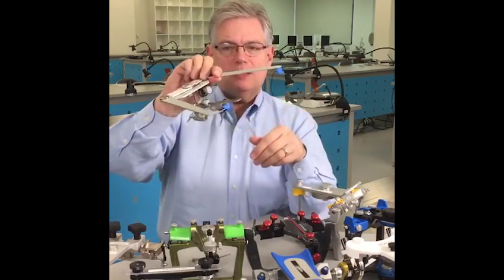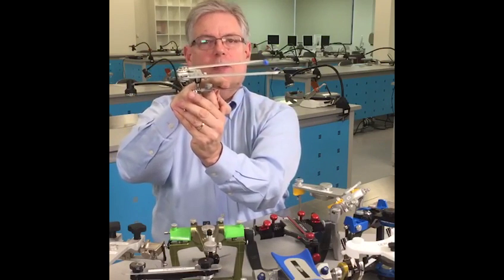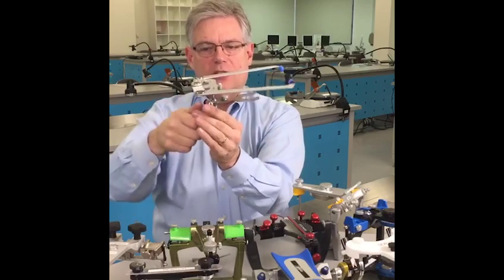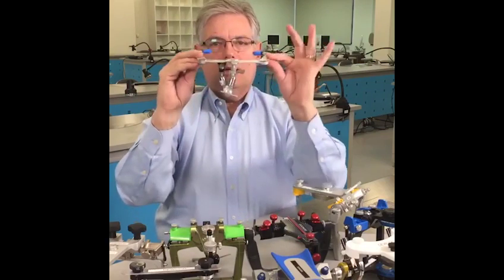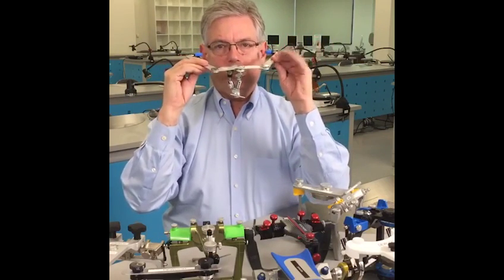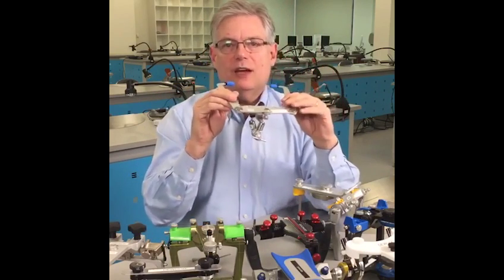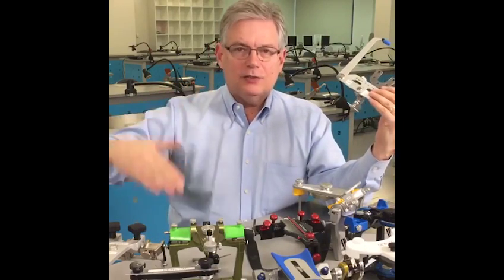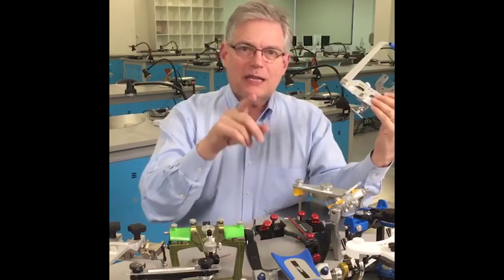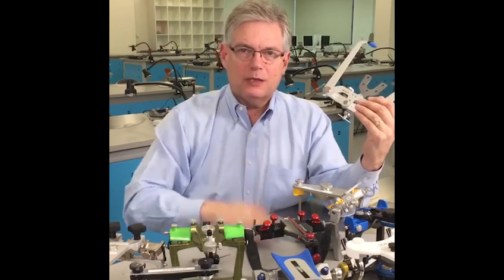I would now go in, and this can be placed on the patient. You can see what's going to happen — this is going to go in the ears, and the teeth are going to set right here in the bite fork and a bite registration that I would have. This one will be really loose. I can now move this around and line it up. When I line it up, I want it to be level with horizon in this plane and in this plane. And if I can accomplish that, what I've done is grabbed a reference — all of these teeth relative to the floor or the bench top — which lets my technician use that information. It also lets them give me a midline that won't be canted because it will be perpendicular to that.